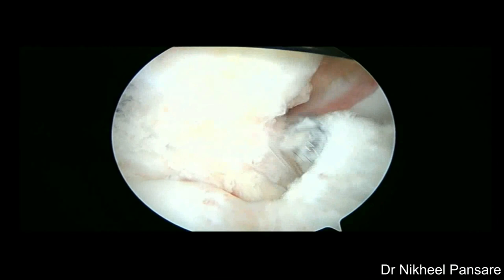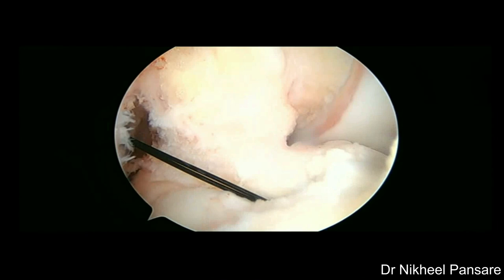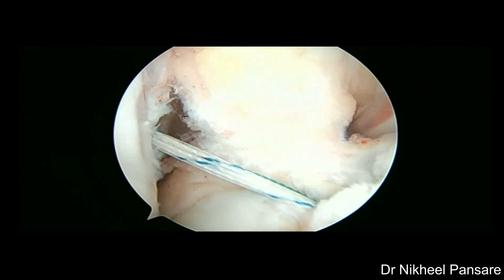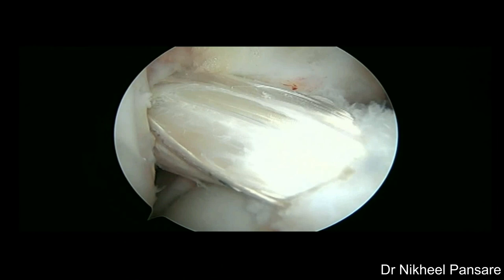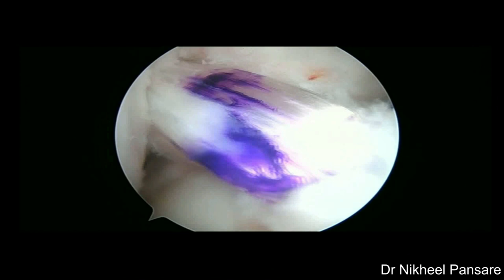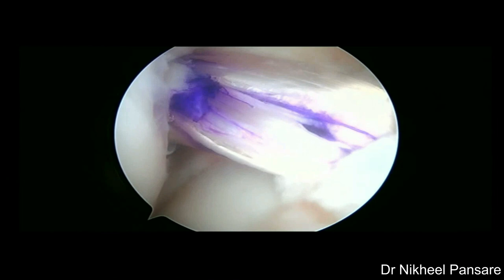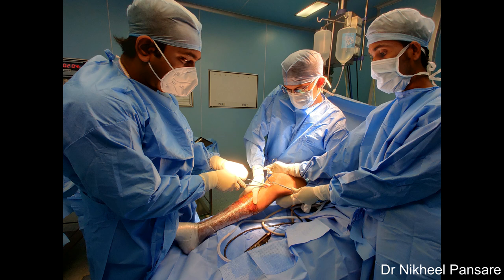Outside, graft is prepared over 20 mm fixed loop. Graft is marked using marker pen at 25 mm, which was our femoral over-drill line. Loop button threads are passed through tibial and then femoral tunnel with help of loop ethilon. Separate the threads outside. Hold white leading threads and pull gradually without touching the green non-leading threads. Carefully take out the slack in non-leading green threads in between slowly. Pull the leading tiger thread until graft goes into the femoral tunnel till the marking. Gently try flipping the button — don't apply too much force while attempting flipping, as forceful attempt may blow out the lateral wall and end up flipping the button over the IT band. Premature forceful flipping may lock the button within the femoral tunnel itself. If it is hard to flip, gently try pulling the graft further and reattempt the flipping. After successful flipping, you can have the typical dancing flip-off button. Leave all threads and pull graft below through the tibial tunnel.